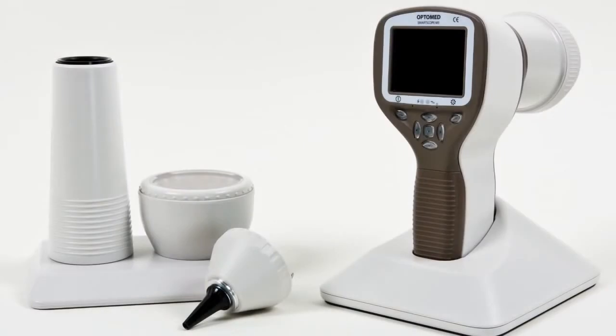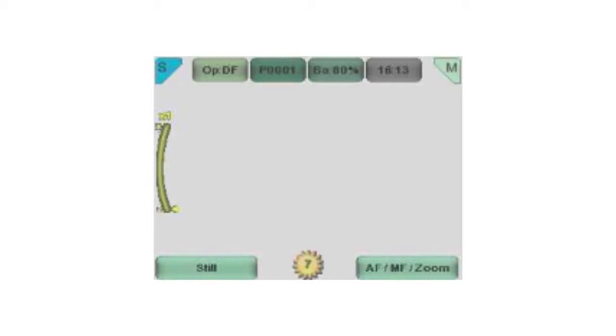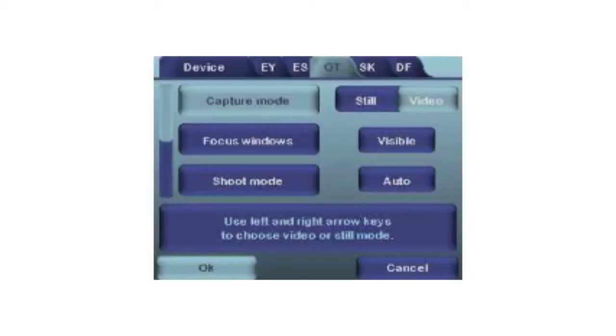Image settings. Capture mode. Still or video capture mode is selected by pressing the left soft key. The icon on the top left corner of the screen indicates the selected mode. The capture mode can also be changed in the OT menu. To activate the menu, press and hold the right soft key.